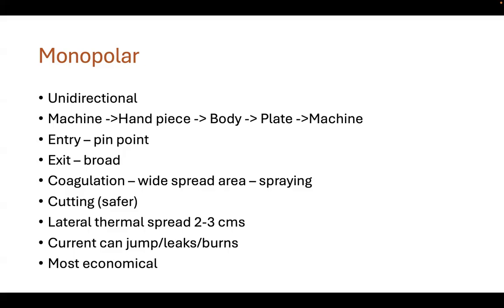Even if you use cutting or coagulation mode, the tissue will get cut. There is no doubt about it, but it is going to come at a higher cost, higher lateral spread, higher thermal damage. And there is a phenomenon in monopolar that when there is a high amount of resistance, there is a chance of current jumping to various sites. For example, if you've got the bladder close to the area where you're activating the monopolar, due to the high resistance, the current can jump to the adjacent tissue. It can be either the bladder, it can be the bowel. So this makes monopolar very dangerous if not properly used.